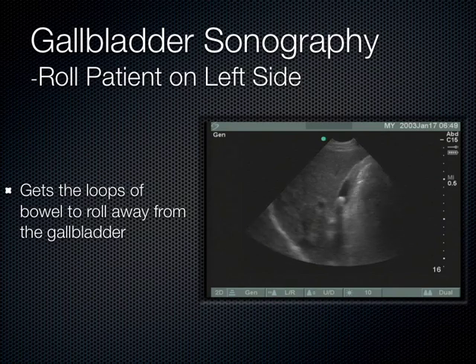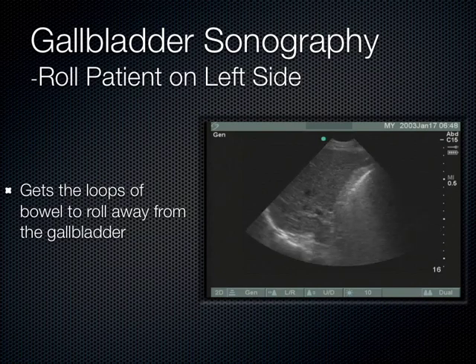Now, what you're going to hear next is a prior ultrasound fellow of mine named Will Scruggs, and he's made it his life's work with ultrasound of the gallbladder. So I captured a video of him showing the technique he uses to scan the gallbladder.